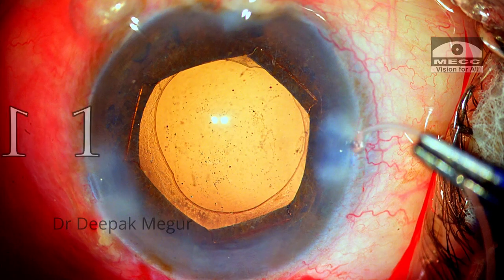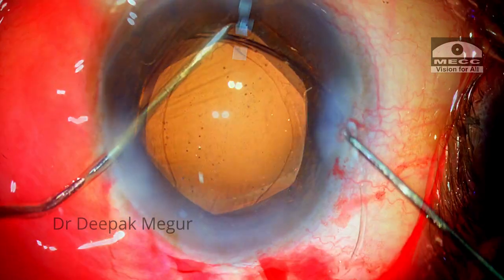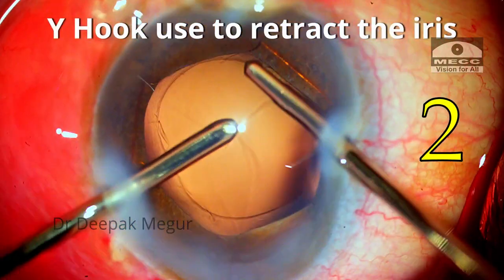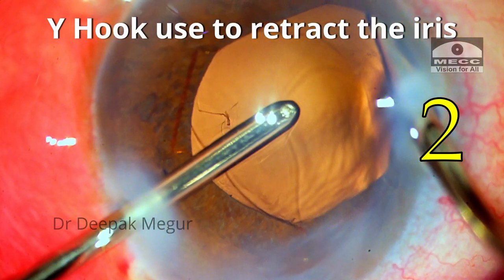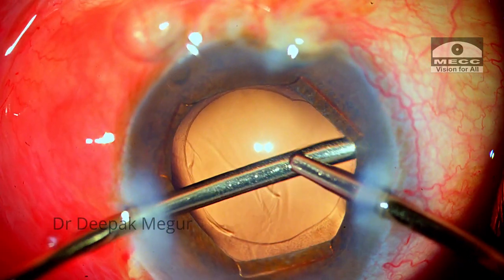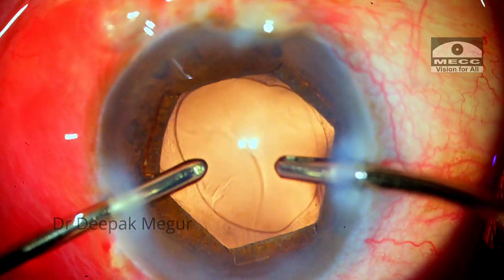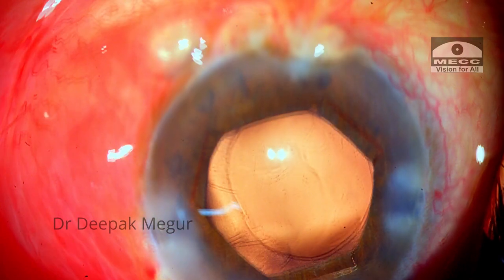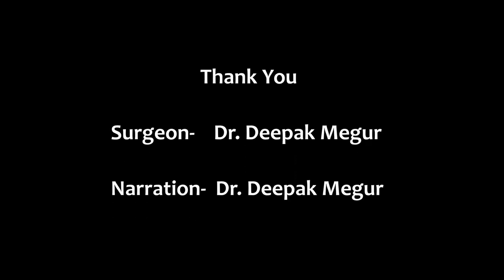If given a second chance, I would have placed the CTR much earlier — right after hydrodissection — to provide counter-traction during nucleus maneuvering and rotation. Secondly, instead of retracting the iris with an irrigation handpiece, I would have used a Y-hook or Couglan hook to retract the iris, because the fluid from the irrigating cannula gushed across the zonules and entered the area posterior to them. The key lesson here is: whenever we see a sudden change in the shape of the rhexis, it is an indication of a localized area of zonular compromise. Thank you for your attention and I hope this helps.